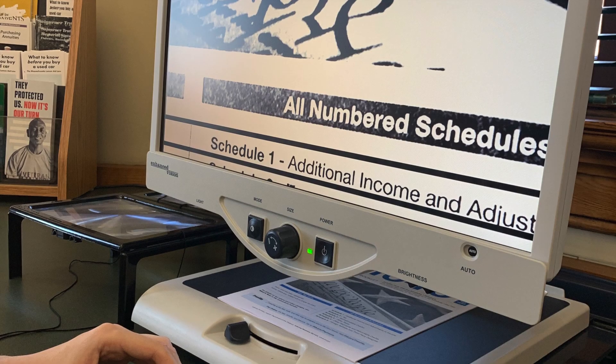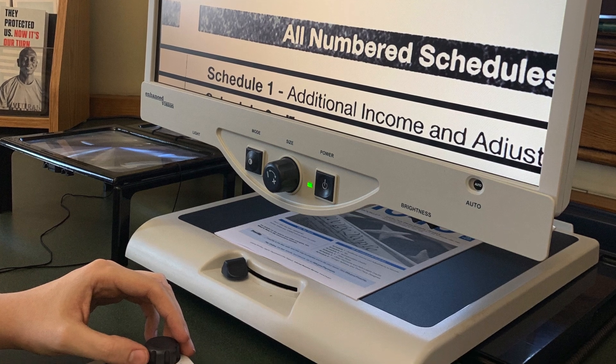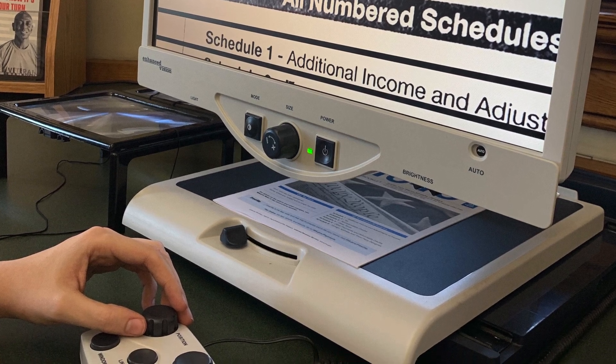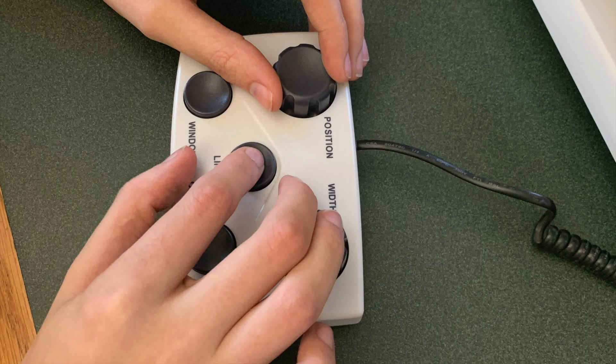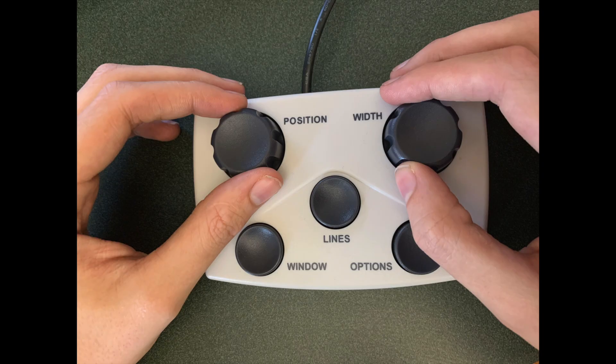The main use of this controller is to add lines to the screen and adjust the position and width of the two lines as needed. To add lines to the screen, you can press the central button labeled lines, and you can use the options button to rotate the lines from horizontal to vertical. To adjust the space between the two lines, you use the width knob, while the position knob allows the set of lines to be moved side to side or up and down, depending on if the lines are vertical or horizontal.